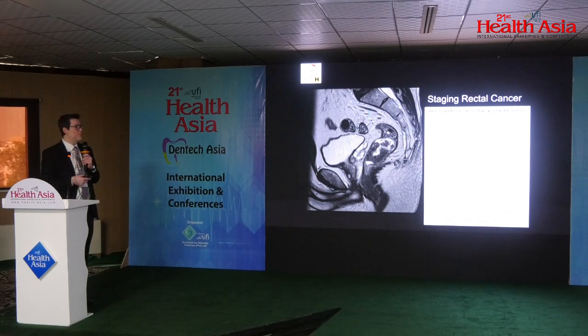We normally try and use this algorithm. It is the Society of Abdominal Radiologists algorithm for reporting rectal CA. They had an update that came out in 2022. You can't read this very well over here, but it tells you about the distance of this. So there are multiple markers that you have to put up in the report.